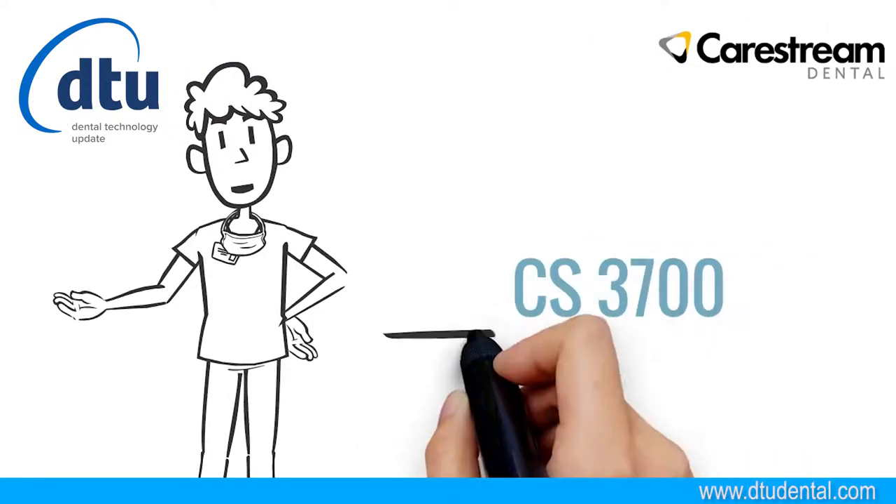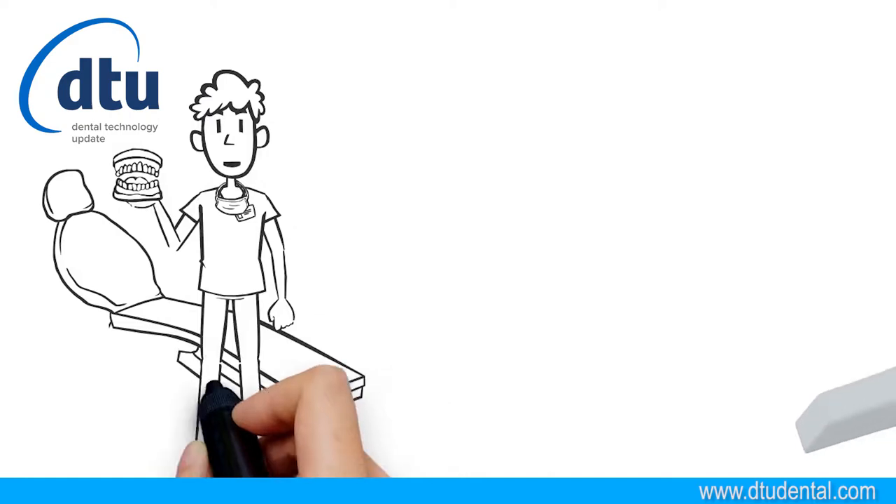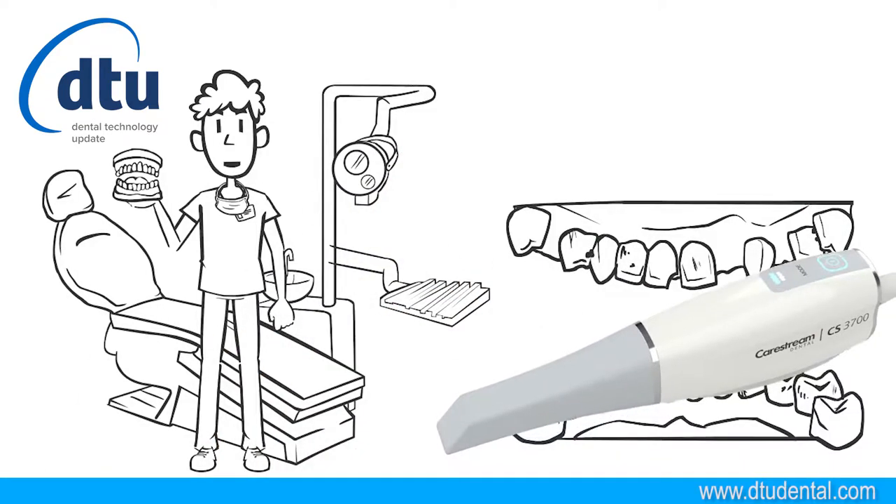Hi there. Congratulations on your purchase of the CS3700. Welcome to fast, accurate, and easy digital impression capture. Whether your practice handles restorative, orthodontic, or implant cases, the CS3700 intraoral scanner from CareStream Dental puts smarter scanning in your hands.